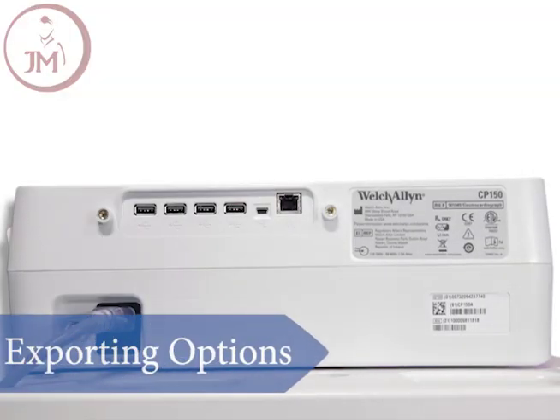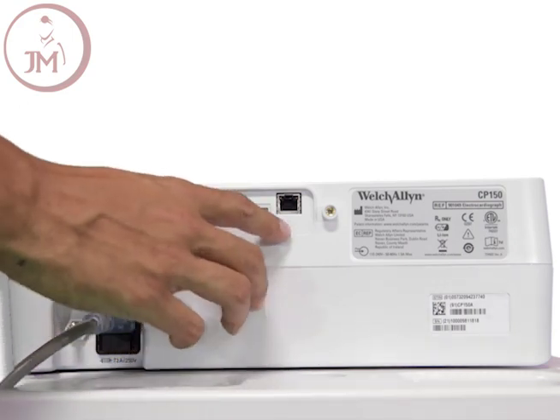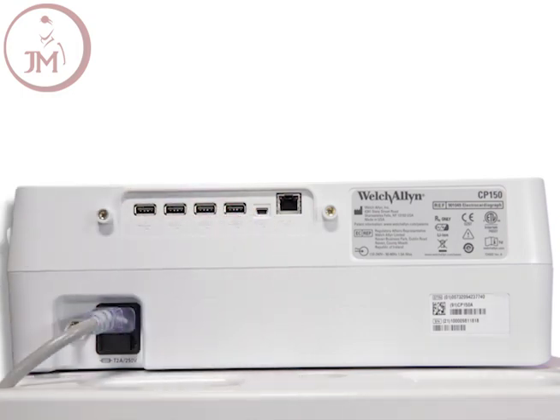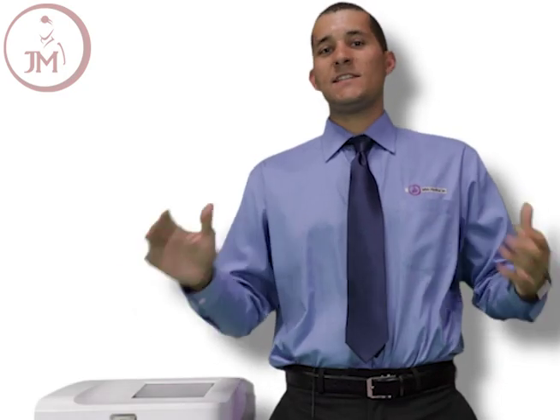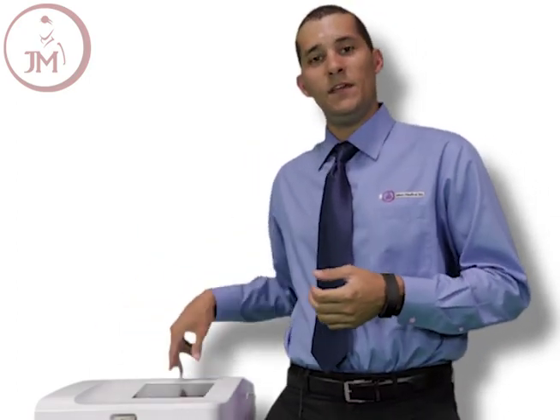One of the key features of the Welch Allen CP150 EKG machine is going to be the exporting options. You'll have the ability to export via LAN or USB. Welch Allen has some of the biggest EMR partners, such as Allscripts, Epiphany, and Eclinical.